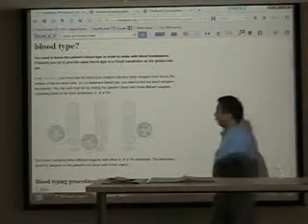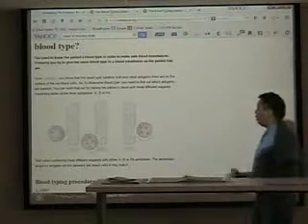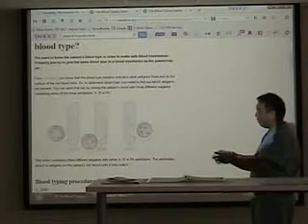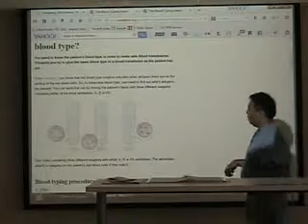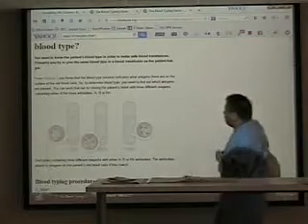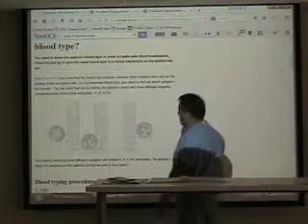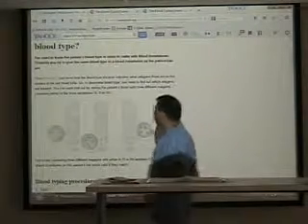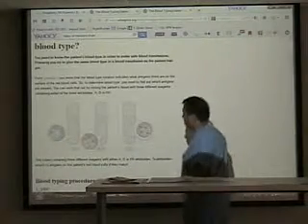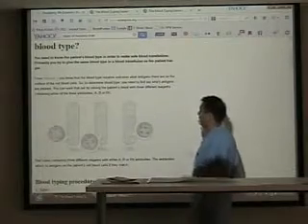Now, you'll be given 3 tubes. Tube A, Tube B, Tube RH. In the real world, you're given this little plate with these little wells, and there will be 3 sections: A, B, and RH. Then you'll put reagents in it, and these reagents have antibodies. So another question I could ask you is, what's in the A tube? You'll see little antibodies there. That's A antibody. What's in the B tube? B antibody. And what's in the RH tube? RH antibodies. Okay?